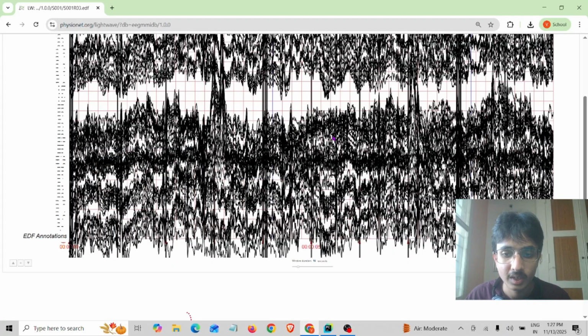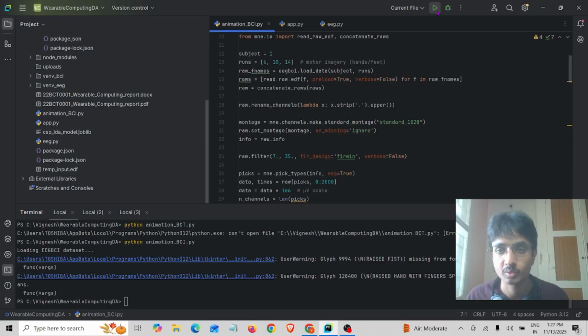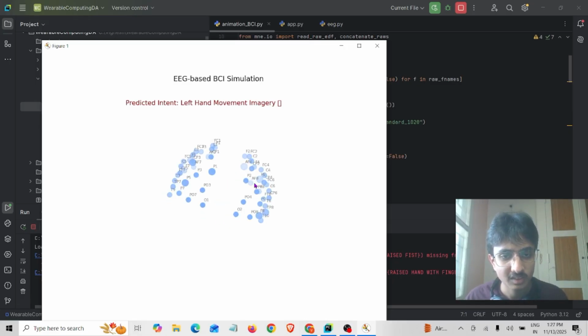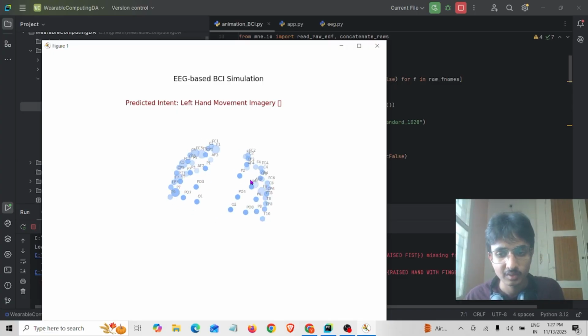Now let me show you a simple animation of how electrodes are placed on the brain. Here I am going to show a 3D visualization of electrode placement. Let me run the script, loading the EEG BCI dataset. Okay, the animation you can see here is a basic 3D animation with the standard EEG 10-20 system.